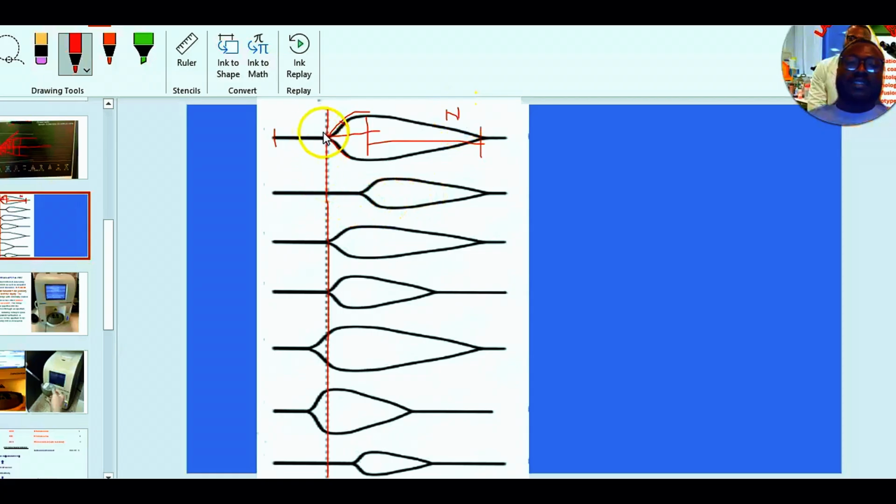Let's look at this. Here, this is the normal R time. Here, it has exceeded the normal R time. It's gone to this side. It takes a longer time for the R time or the reaction time to end, meaning either we don't have enough clotting factors here, or there is an inhibition, which means the patient is probably on heparin or an anticoagulant that is inhibiting the clotting factors from making an initial clot formation.